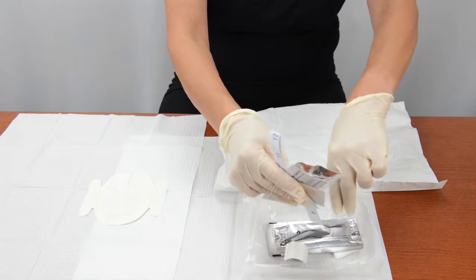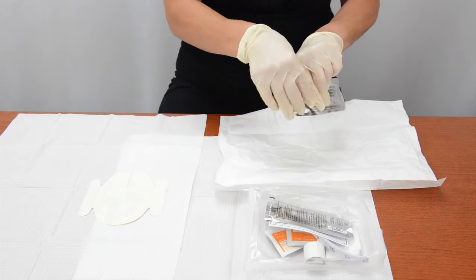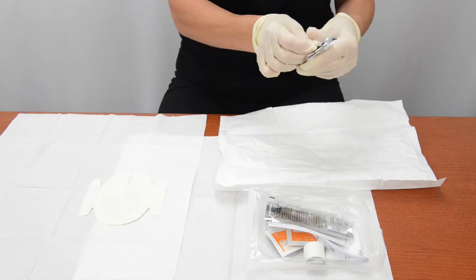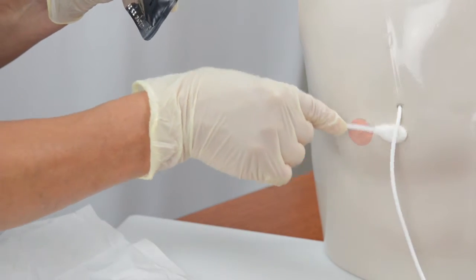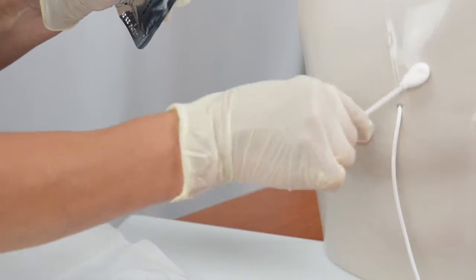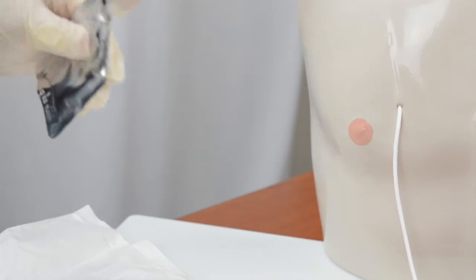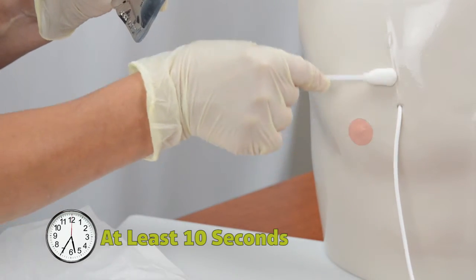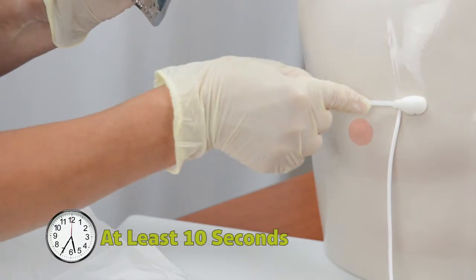Remove the chlorhexidine swab stick from the bandage change tray and open the package. Use the swab stick to clean the catheter exit site, the catheter, and the patient's skin that will lie under the bandage. Scrub the skin in an up and down, back and forth motion with one swab stick for at least 10 seconds. Repeat the 10-second scrub with each of the other two swab sticks in the package for a total cleaning time of 30 seconds. Allow the skin to dry completely — it may take several minutes. Do not fan or blow on the skin to speed up the drying process.